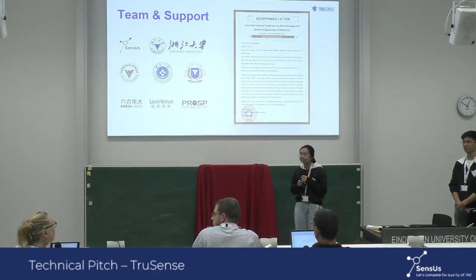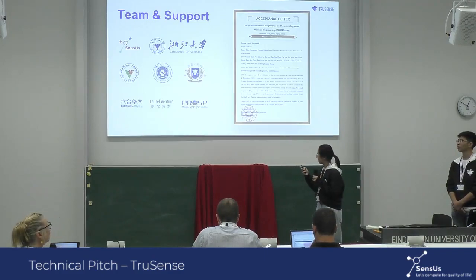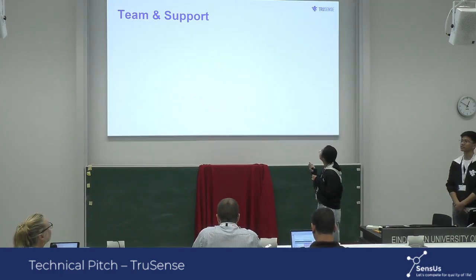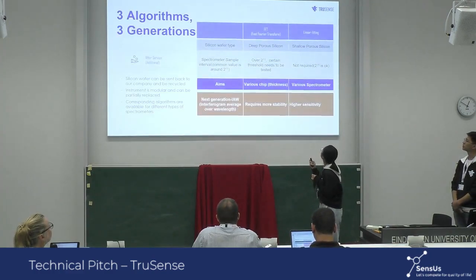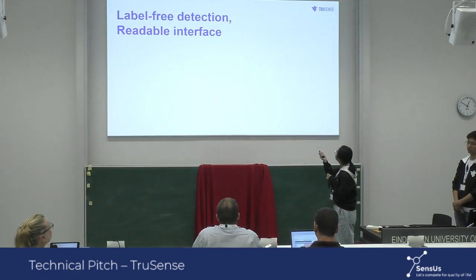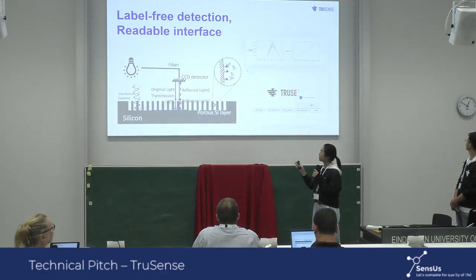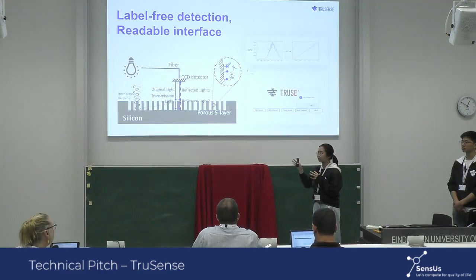And so can you tell me a little about your calibration assay? Because this is very important for interpreting your results, right? Because it kind of varies a little. So your calibration algorithm? We use linear fittings, and we have this photo here. Because we use these interference reflection spectrums.